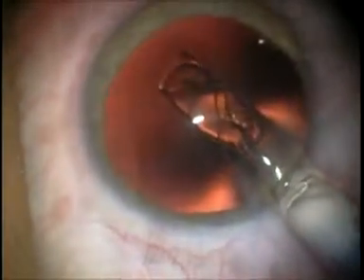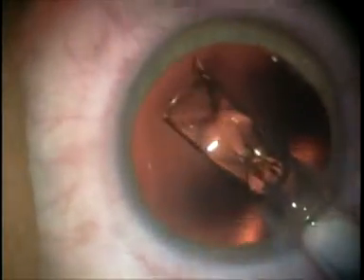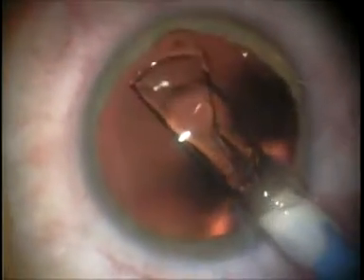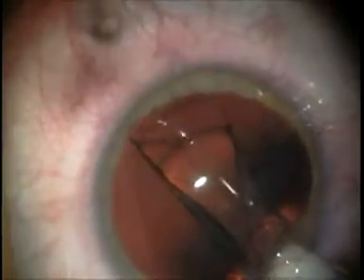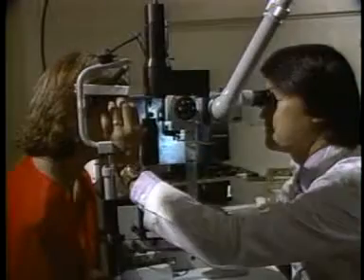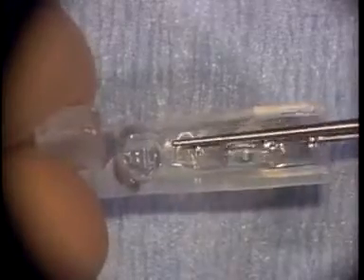Star Surgical's Vizion Implantable Colamer Lens, or ICL, offers a new innovative option to your patients and to your refractive practice. Viewing this program will provide you with the information you need to familiarize yourself with the Star Surgical ICL. This chapter will guide you through the entire process of patient selection, preoperative planning, and loading the ICL into the Star ICL injection system.